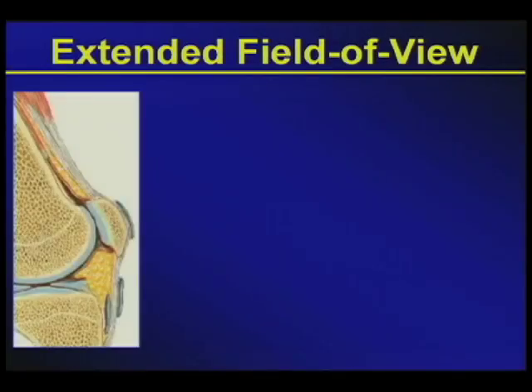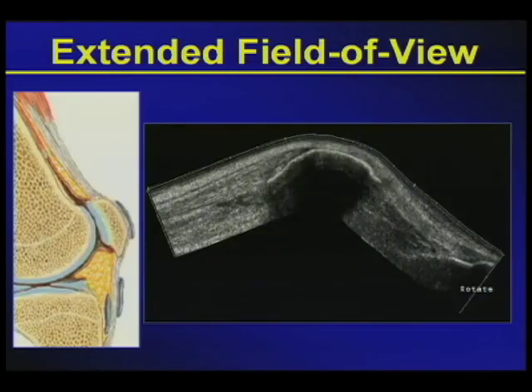Today, with the extended field of view of ultrasound, you can appreciate the fidelity of ultrasound grayscale imaging to the known sectional anatomy presented by Netter. Starting from the top, you see the multi-pennate structure of the distal quadriceps muscle, merging itself into the musculotendinous union or junction, into the fibrillar pattern of the distal quadriceps tendon, to the bone acoustic landmark of the patella, back again to a fibrillar pattern of the patellar tendon, and inserting into the bone acoustic landmark of the tibial tuberosity.